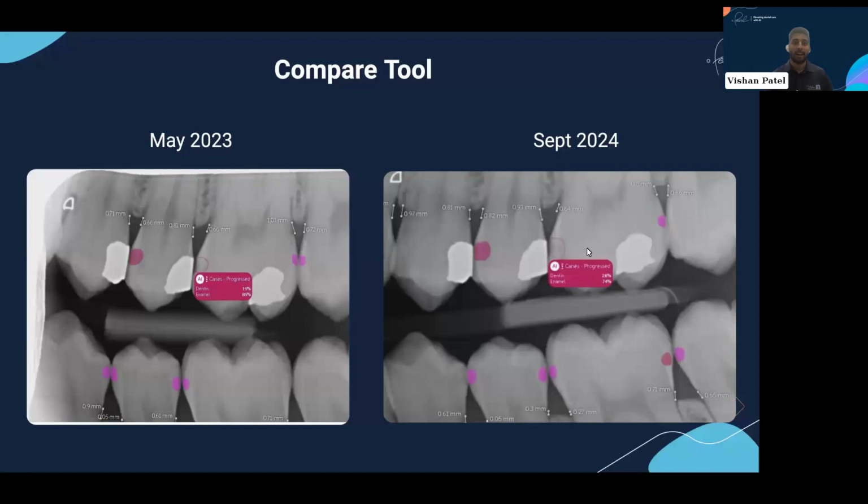In my experience, I've now seen a lot more uptake with these types of patients who normally prefer to leave decay because they're not getting any symptoms. It also gives a patient the realization that things are worsening. As you can see in this x-ray, he's got a lot of enamel lesions. These could all turn into fillings if he's not careful, if he's not seeing the hygienist, not cleaning in between his teeth. So it does give a patient a boost to start cleaning their teeth a little bit better. Luckily, because of this, the patient is booked in for treatment next week, so that's great.